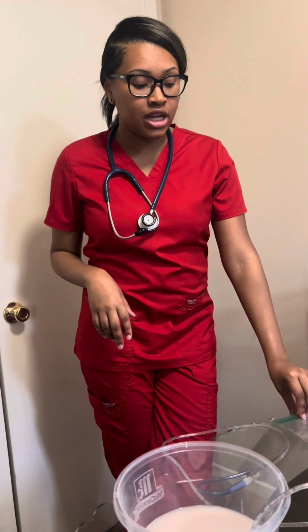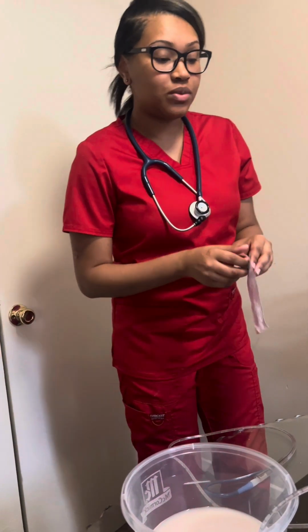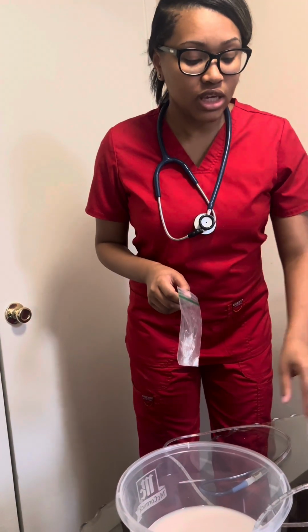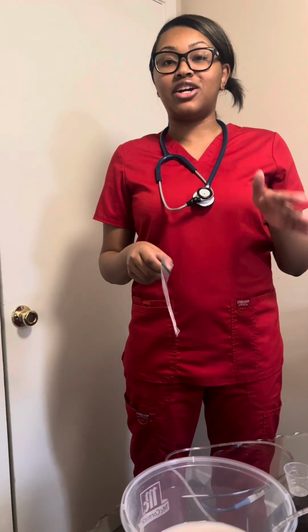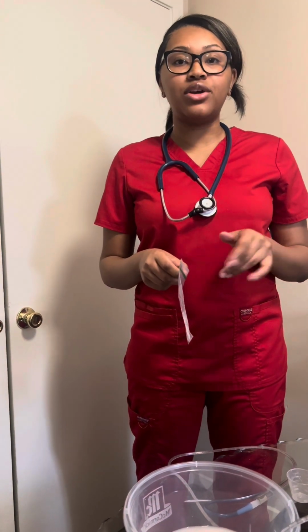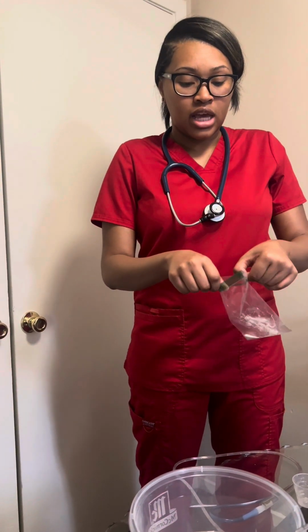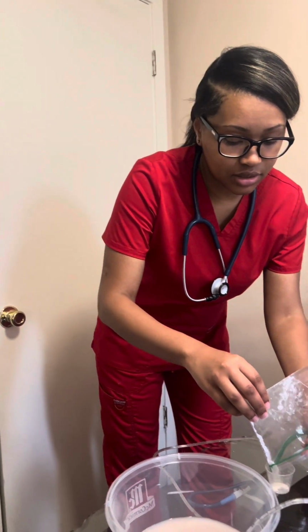I will do the 7 rights, which are right patient, right medication, right dose, right route, right time, right reason, and right documentation. And then I would get my medication and crush it, which I have already done. Also, if it's enteric coated, extended release, or sustained release, it cannot be crushed. And then I will put it in the medicine cup.